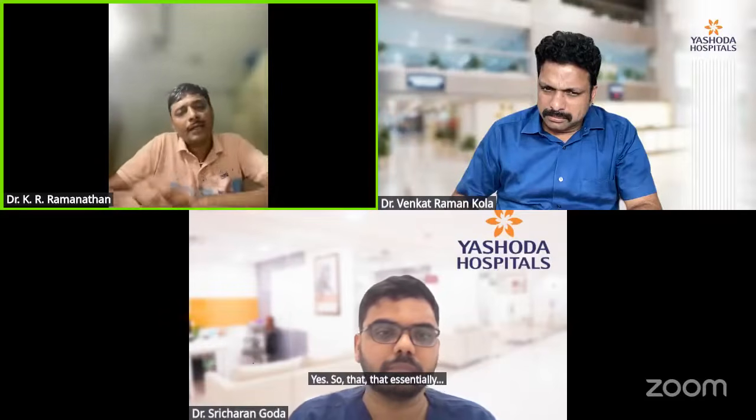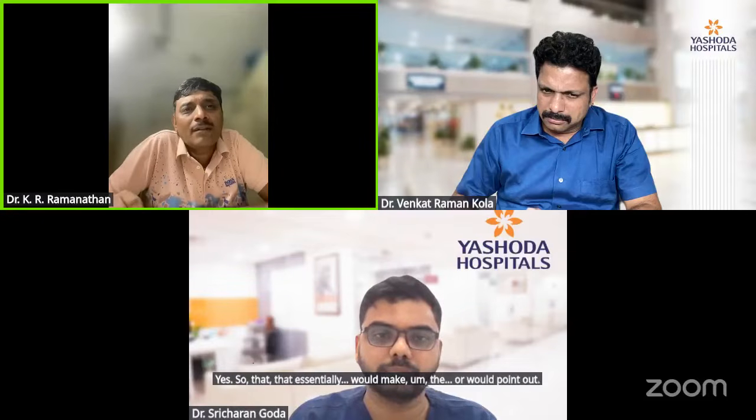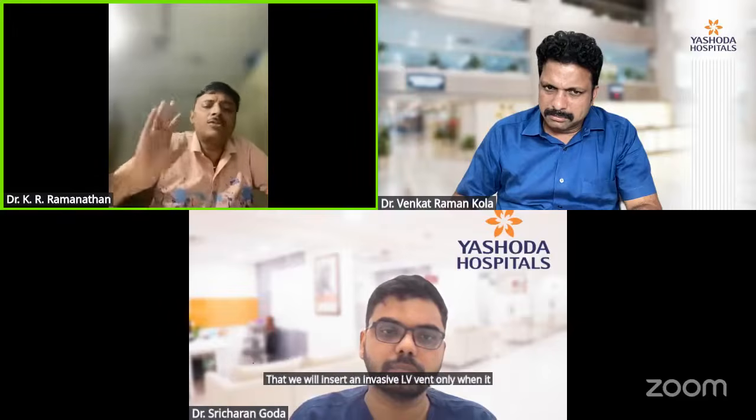Some of the questions are related to the dimensions of indication for LV venting. Yes. So that essentially would point out the time where LV venting is absolutely needed. So for now, I think we are all embarking on the track that we will insert an invasive LV vent only when it is absolutely needed.